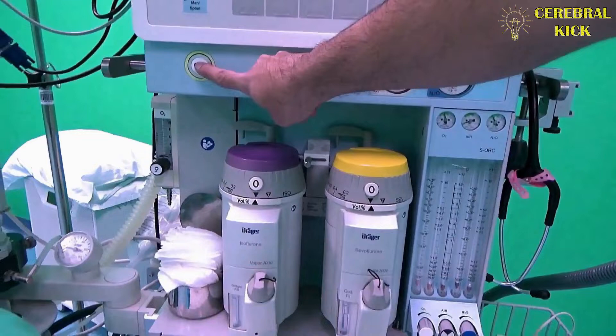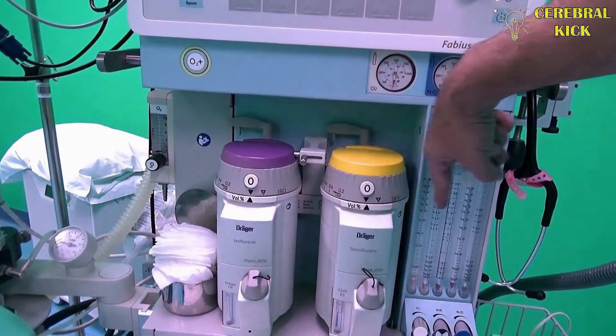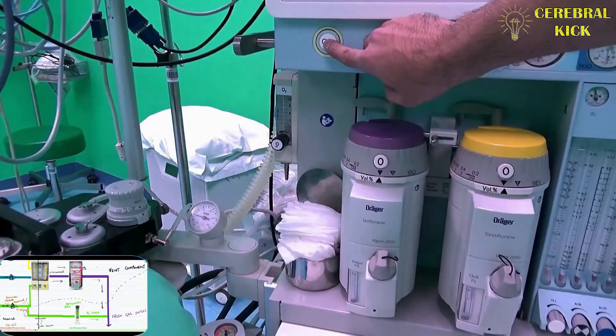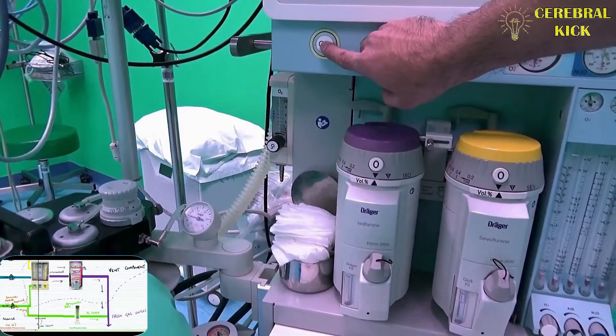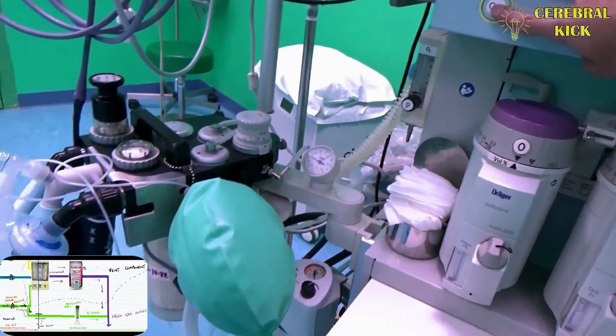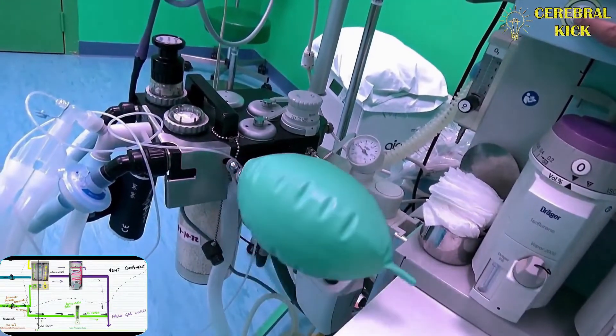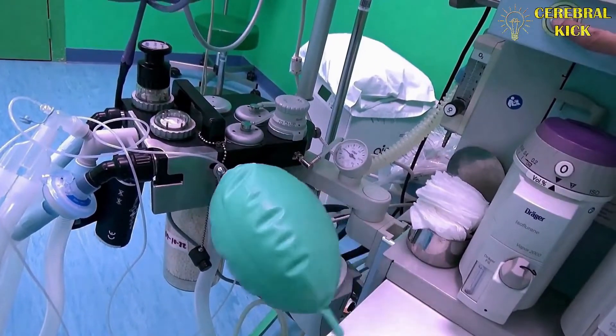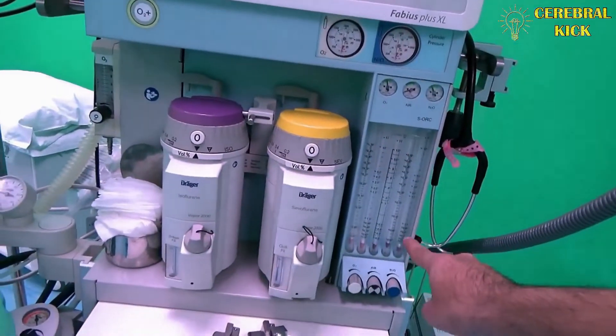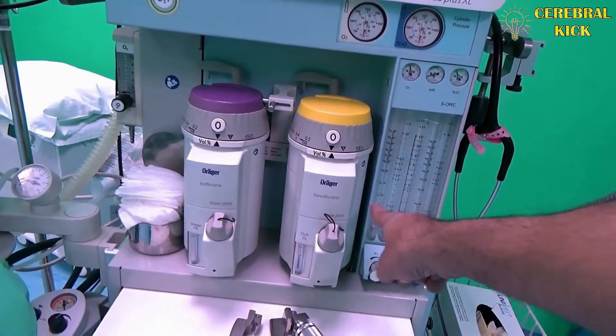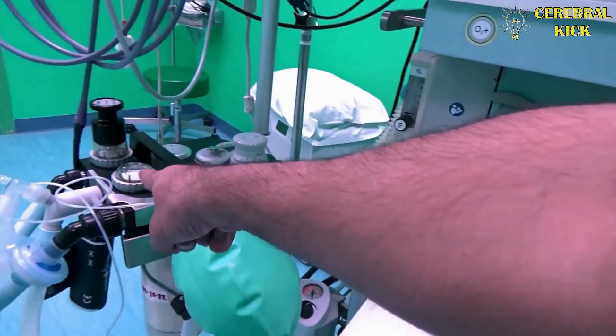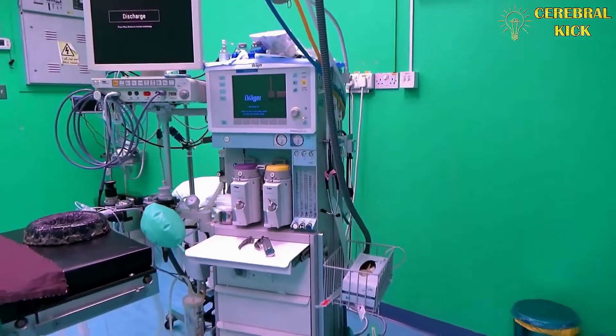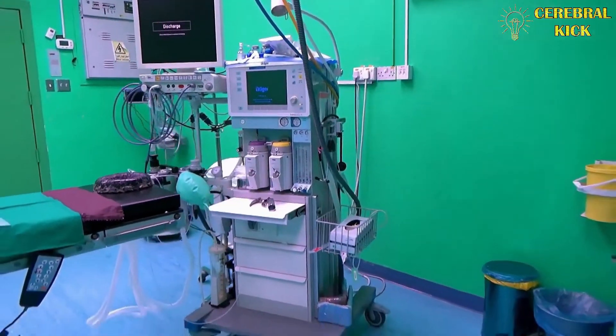We discussed that the oxygen flush bypasses the low pressure zones of vaporizers, flow meters, and the breathing circuits, and it directly delivers a thrust of oxygen to the patient. So if I press oxygen flush here, what would happen? See, the gases have gone directly into the breathing circuit. It has bypassed the intermediate zone, the flow meters, the vaporizers, and it has gone straight to the patient circuit. These are the pressure zones that we have covered in the overview of the anesthesia workstation.